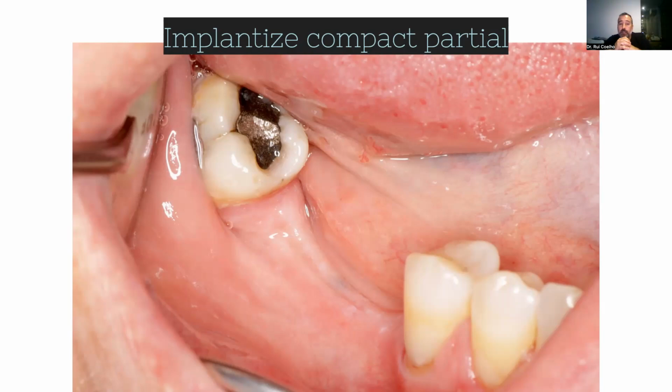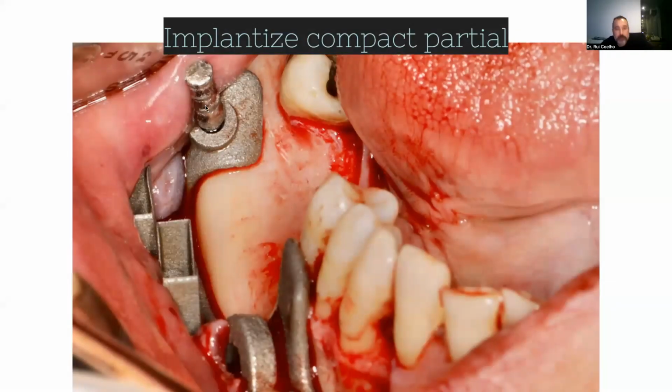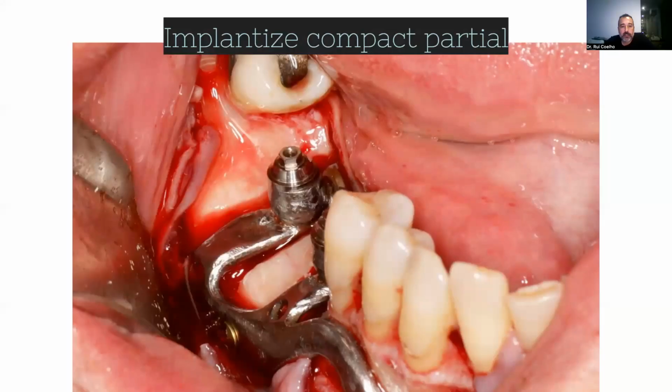So it was decided by the clinician to put here an individualized implant. So the same principle, putting a guide, and this guide will make the bone preparation, and the bone preparation is about 1 millimeter, 1.5, not much more than that. And you can see here that we came to the oblique line from one side, the internal and the external, to hide our plate, okay?